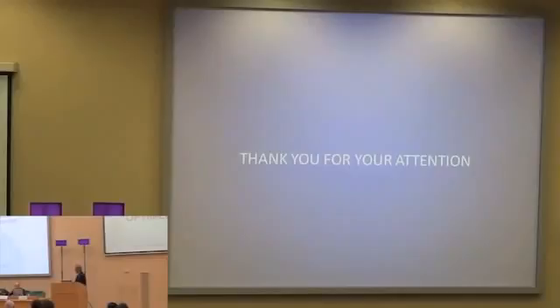And the number of people, I think, differs from country to country. I think it depends on the attitude of the people in the country. If you are very uptight, perfectionistic, you want everything right, you will be less inclined to be happy with this lens. If you are more relaxed, I just don't want to wear glasses, I want to enjoy life, and I want to see, then this lens works very well.